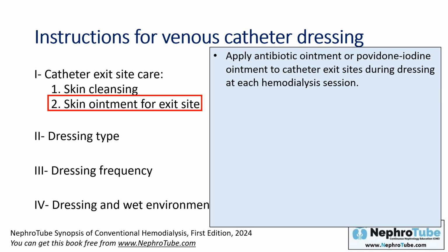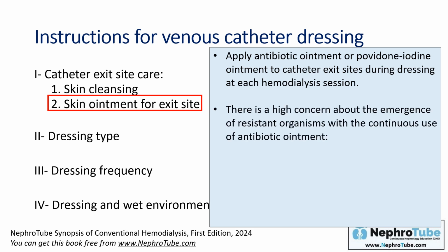But if you use multiple antibiotic ointments, there is inadequate evidence to prefer one ointment over another. But again, there is high concern about the emergence of resistance even if you use multiple antibiotic ointments.